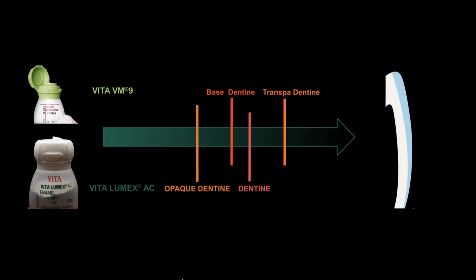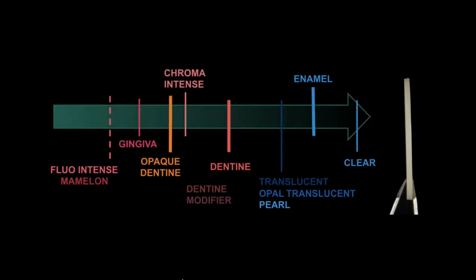I look at the Chroma Pluses in the VM9 or the ECs as mild opacious Dentin. That's kind of the way I've always seen them. We tend to get used to saying opacious Dentin, so it seemed like maybe it was a better way just to call it opacious Dentin rather than confusing people. But in the end, because I'm slightly more opacified, it gives me a little bit more range to work in the materials.